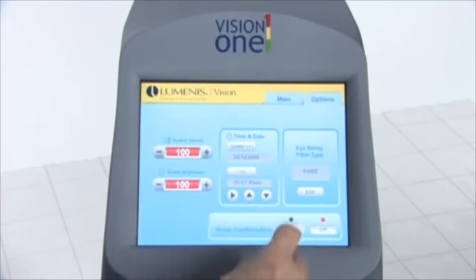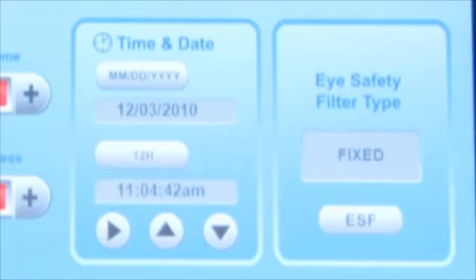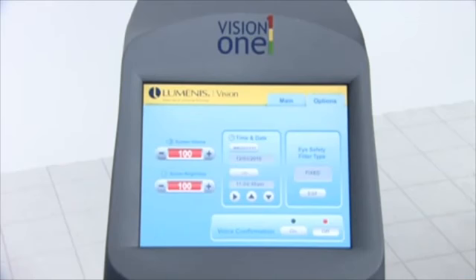System options, such as eye safety filter type, system volume, and screen brightness are selectable from the options screen. One or more of the following eye safety filter modes are available, depending on the type of foot switch, delivery devices, and eye safety filters that you have connected to the laser. Fixed. The eye safety filter is always in position. Moving. The eye safety filter moves into position when you depress the foot switch while the laser is in ready mode. This functionality is available only with automatic eye safety filters. Selectable. The eye safety filter moves into position when you place the laser in ready mode, also available only with automatic eye safety filters.